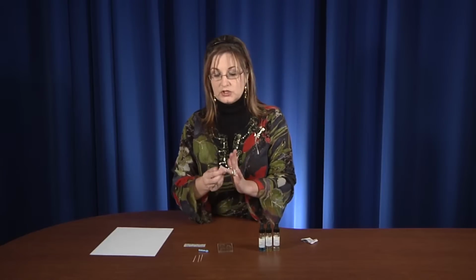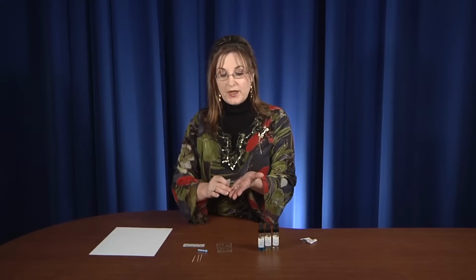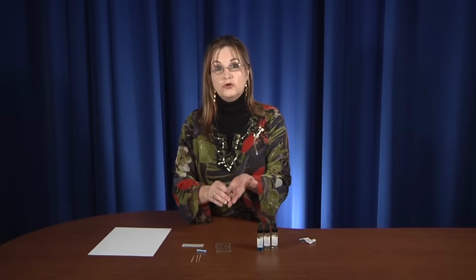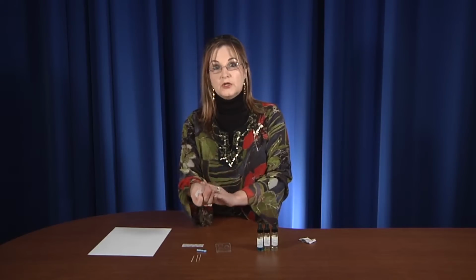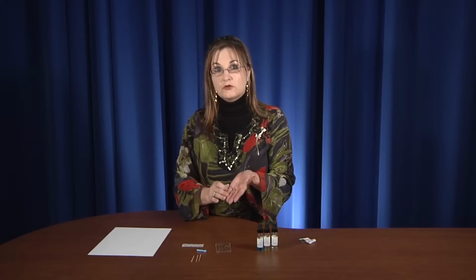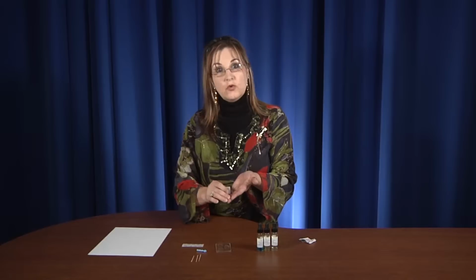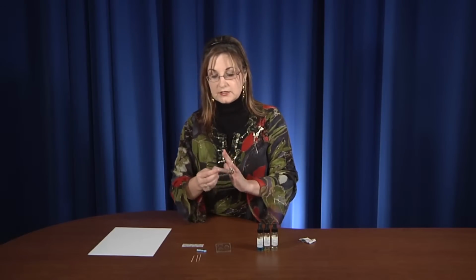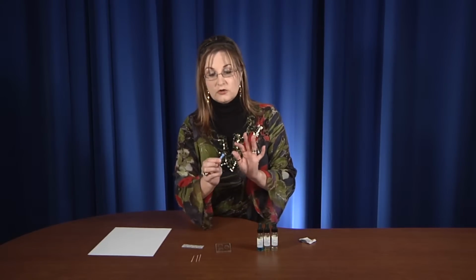Alright, so I suggest that you sterilize the side of your finger. There's a couple of reasons for that. One is the pad of your fingers have a lot more nerve receptors because that's where you touch things. That's what you use to manipulate things in your environment. Also, because you use the pads of your fingers more, they're also going to be more difficult to puncture. The skin is quite a bit thicker. So sterilize the side of your finger, put your alcohol prep to the side, and take your lancet.